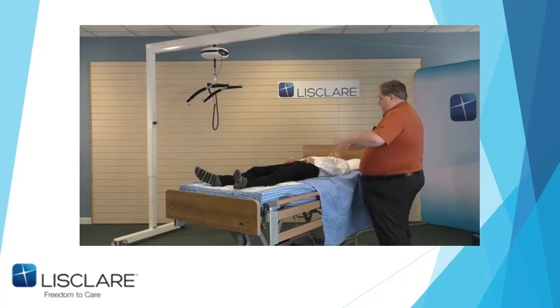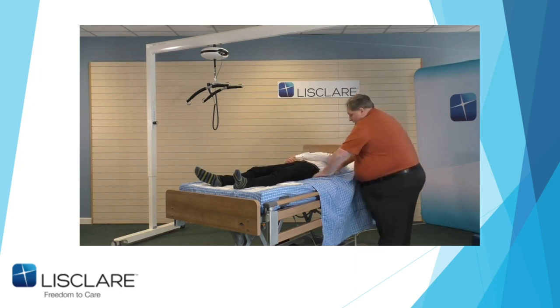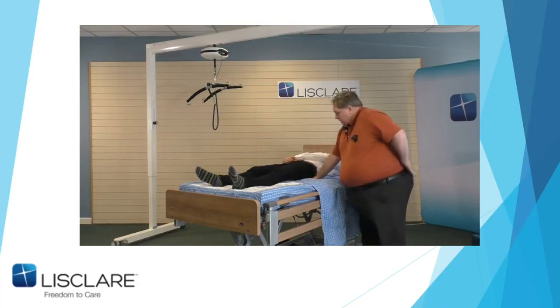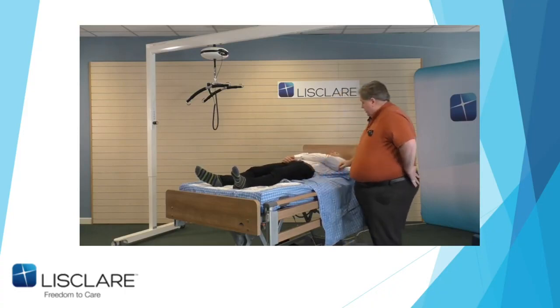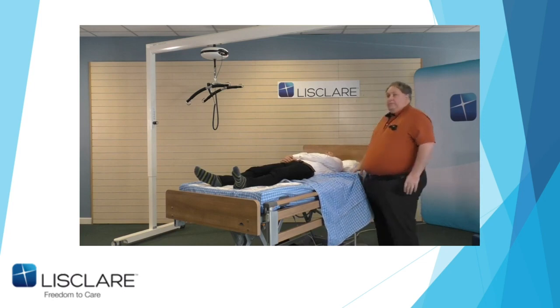And what I tend to do, if I can only work from this side, is I'll bring John's hand across, and I'll maybe just do the hips first, okay? So I'll just place one hand underneath John's hip bone. And if you can see, I can use my body weight, which makes it easier. And there's John moving to the center, underneath the shoulders, over. I know I didn't pull the side rails up at that point, but the reason being, obviously, we know what we're doing, it's only up the bed. The side rails will come more involved when I do turning, okay?